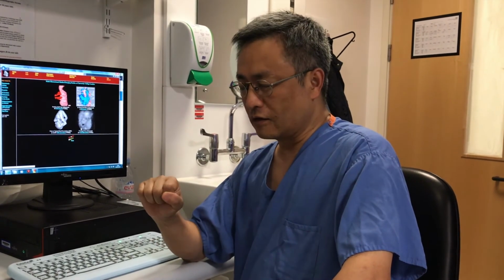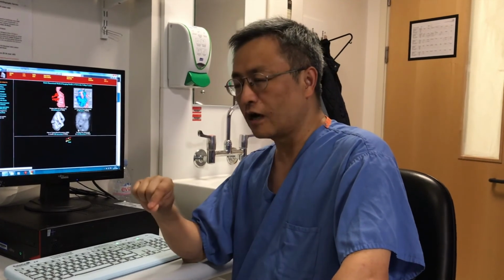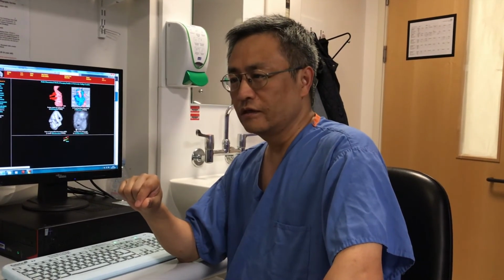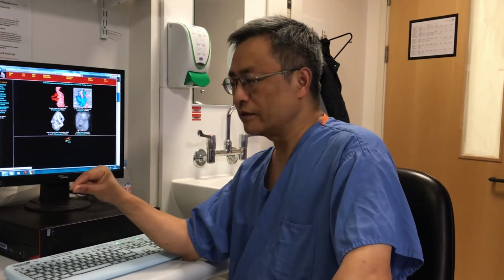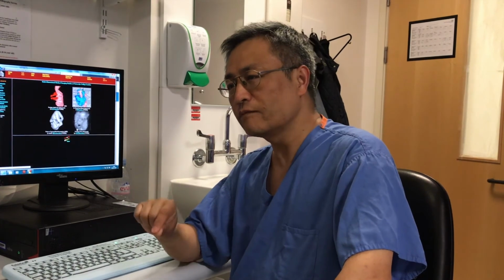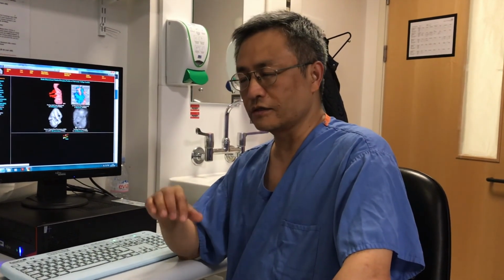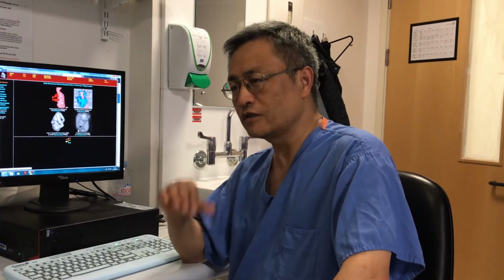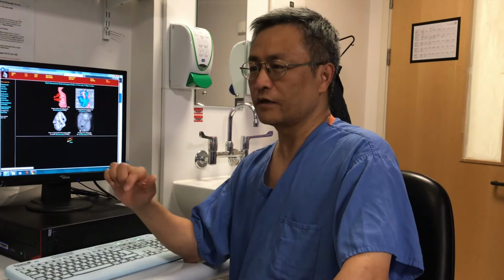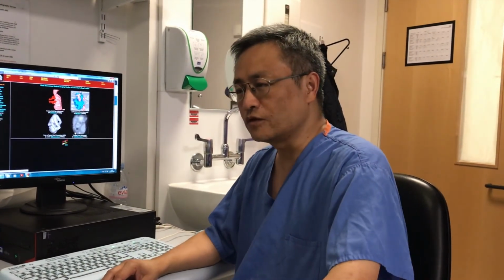So what we use is the fetal heart movement on ultrasound. We call it M mode. From the M mode movement of the heart, we can pinpoint at which time point in the cardiac cycle the heart is imaged or visualized. And then we use that time as a fourth dimension to visualize the heart in 4D to remove motion artifact.